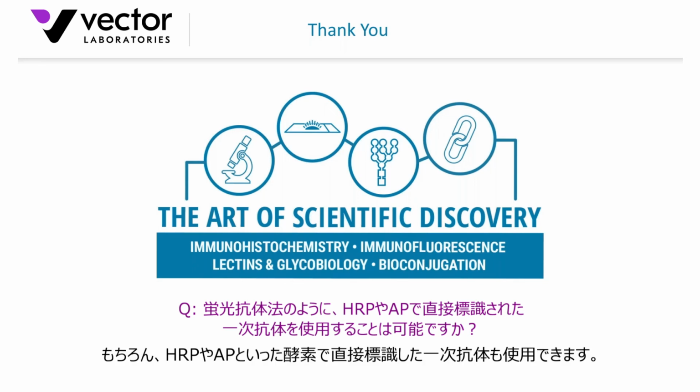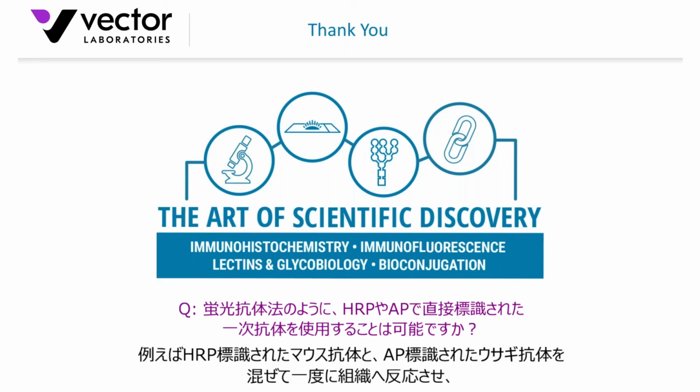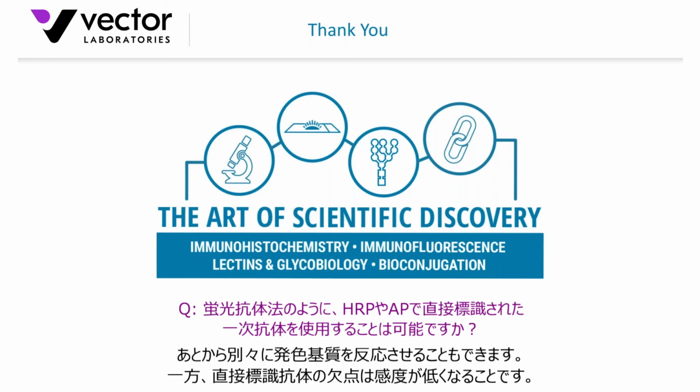Oh, absolutely. Certainly, yes. Some investigators may have primary antibodies directly conjugated with an enzyme, as Byron mentioned, either peroxidase-based or alkaline phosphatase. Sure, you could mix those two together. If one is, say, a mouse HRP and a rabbit alkaline phosphatase primary antibody, you could even mix those two together and then react the substrates separately after that.